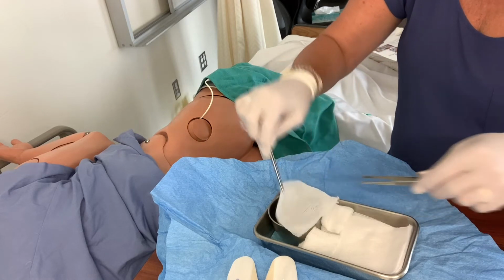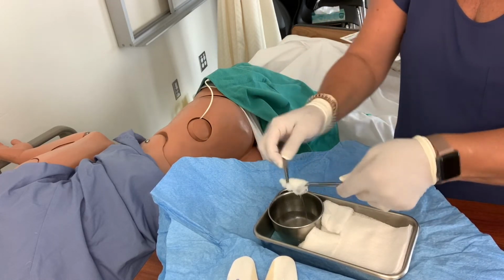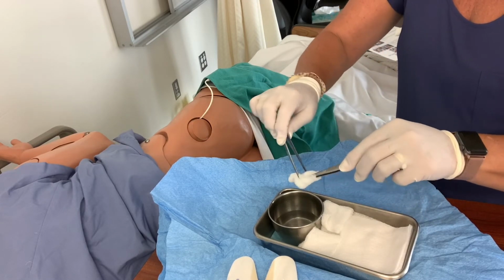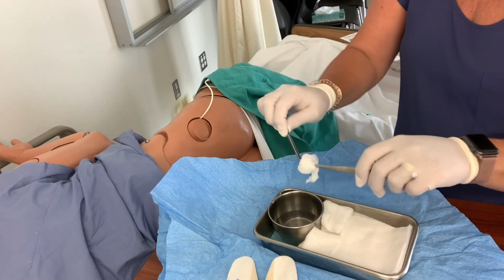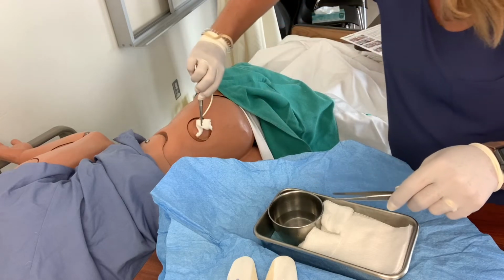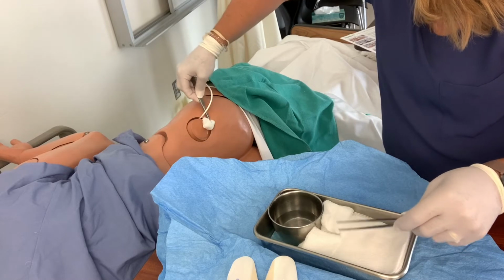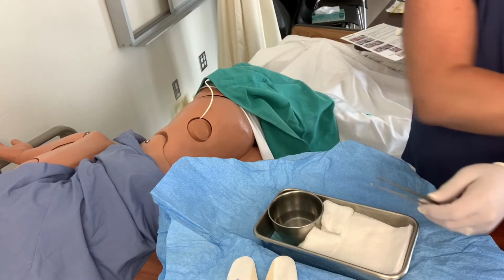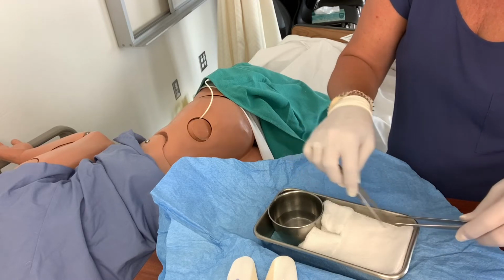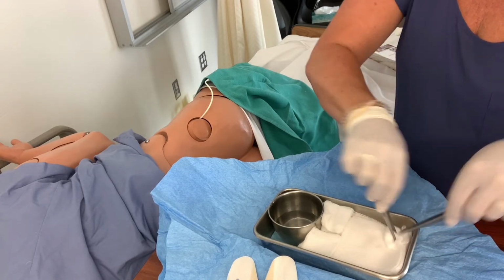Now you can choose to use whatever gauze you like. I know you're using the trays in the hospital, so that's 2 2x2s and 2 4x4s, so you may have to bring some additional materials with you. So get hold of this piece. Okay, so I'm moving further out now, so I'm taking a bigger swath with the cloth. Lift it, try not to touch anything. And you get the gist of that, so I'm just going to start to dry. I'm just going to dry it.